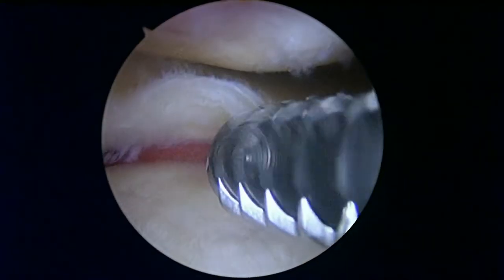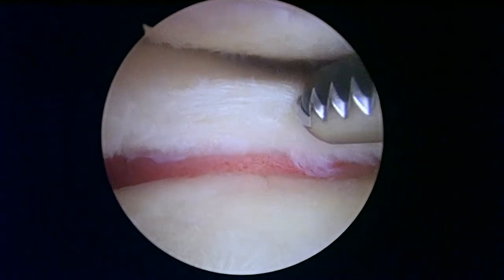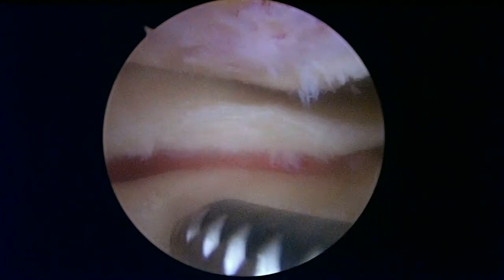You can see how some of these are about to become loose pieces. We're finishing up in the lateral compartment — there's really not much more to do other than remove the obviously loose cartilage and trim back the meniscus in areas that seem like they're potentially causing symptoms in the joint. I think we've done that. Now we're going to look in the patellofemoral joint next.